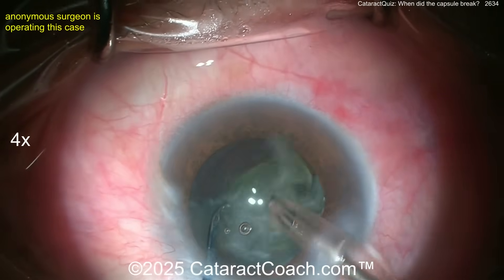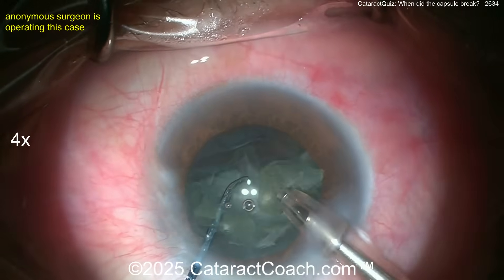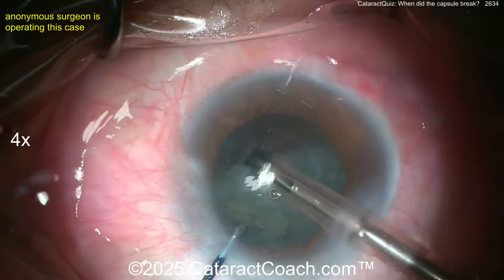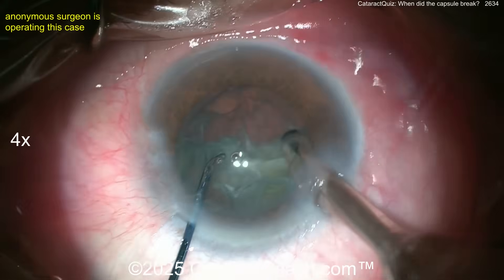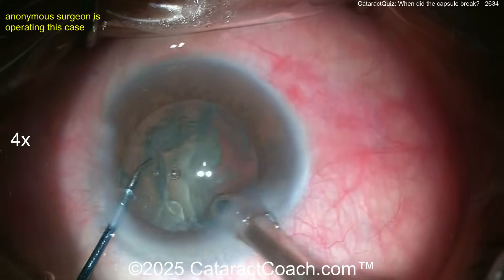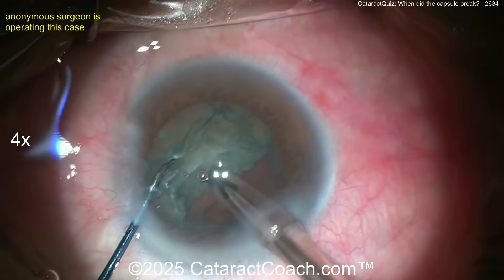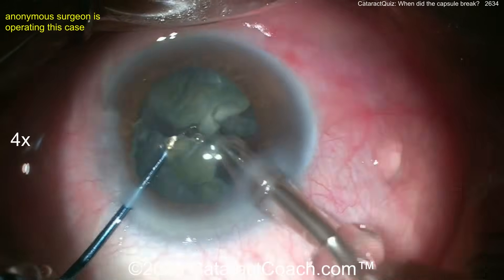The capsule looks intact. We're looking out for a really bright red reflex — so far it looks pretty reasonable. Fluidics are behaving normally; the lens nucleus is not falling posteriorly. It looks okay, maybe a little deep back there but not terrible. Let me know when you think you can finally see the break in the capsule, because the capsule is broken — you saw the snap sign.